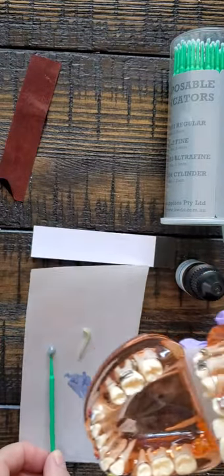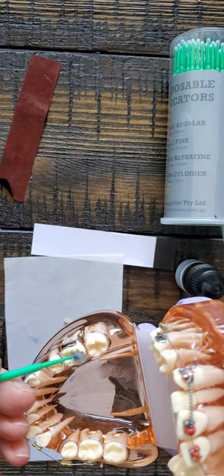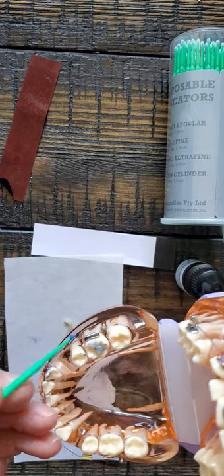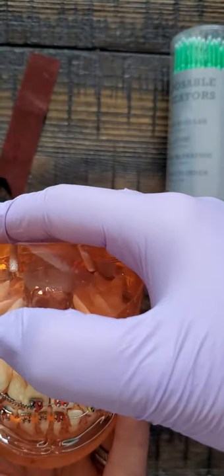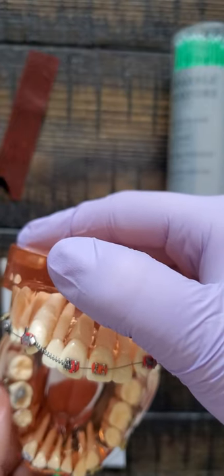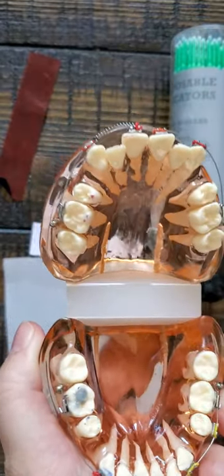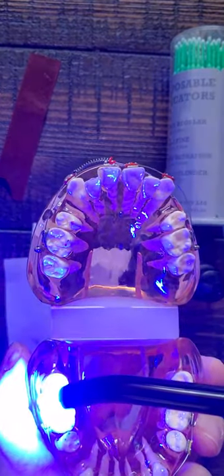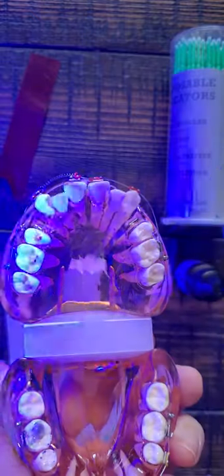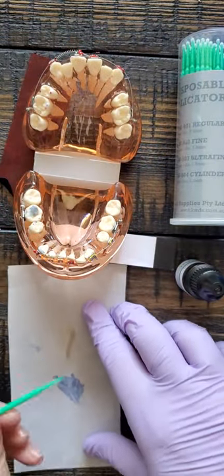Make sure you do it bilaterally. This patient is biting in all kinds of random spots, but I'll put it right there. Then that's pretty much it — I just put it on. Sometimes I'll have them lightly tap down. It's a little different on a manikin than on a real patient. Then I go ahead and light cure. I'm going to pause for a second when I finish light curing and then we'll show you. We've got to do that bilaterally, so I have two of these here — let me go ahead and do the other one.